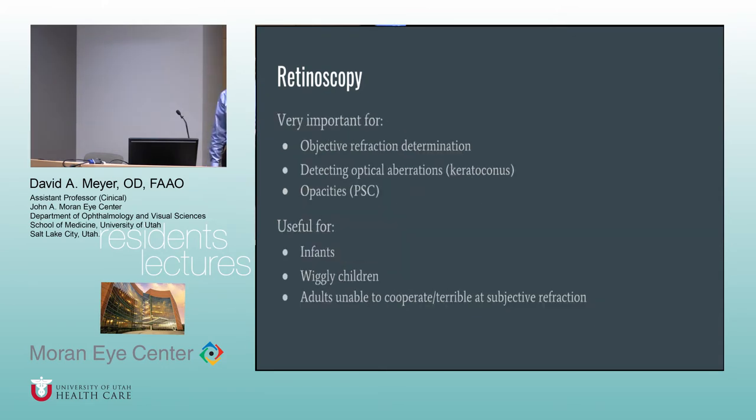Or, like I said, there are some adults that are just simply terrible at subjective refraction, just terrible. You'll change it by a diopter and they'll say, oh, it looks the same to me. And you're like, no, it's not the same. I know it's not the same.